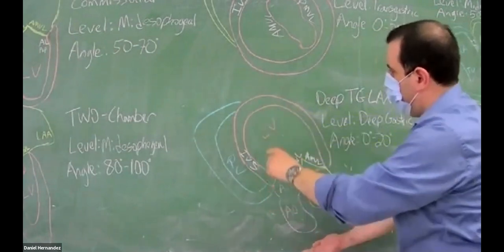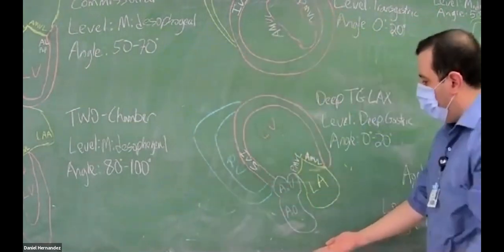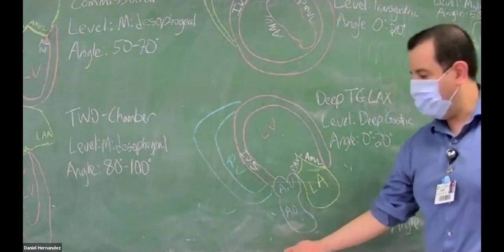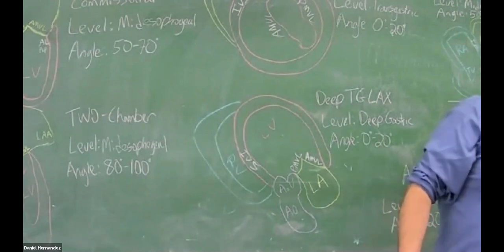So the first thing we're hitting is the left ventricle and then the aorta coming off the top of the heart. That's going to be in our far field, in our far view, the left atria. I'm visualizing the camera down in this view.